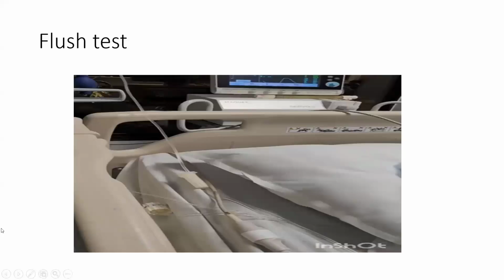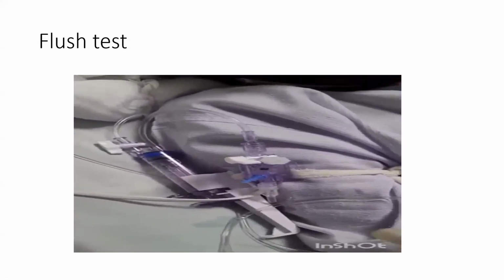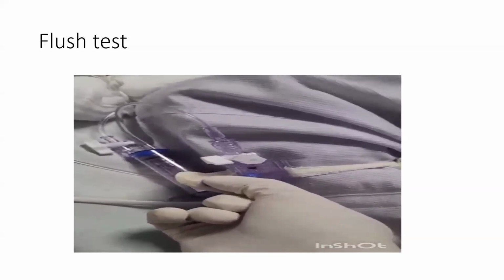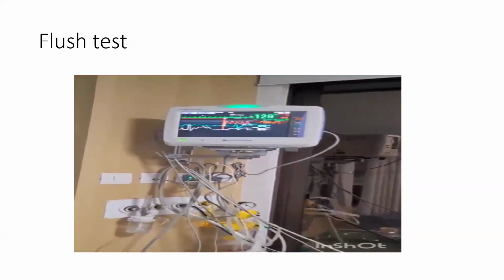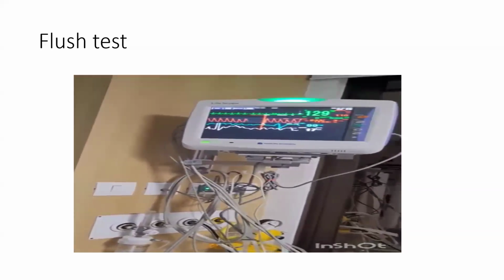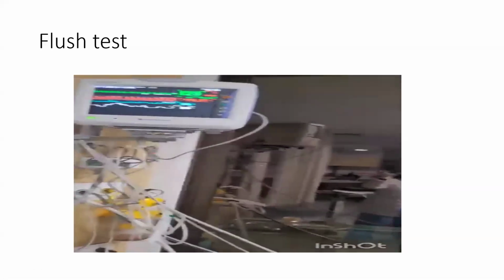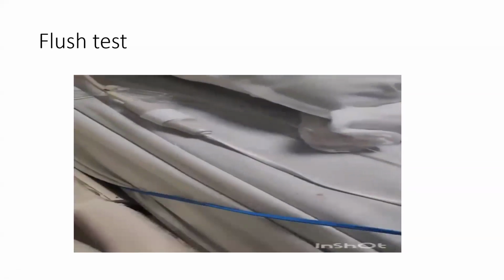Now the next is the flush test. We'll see what the square wave flush test is. After flushing the line, the flat line will come, and after that we can see the oscillations. Now we'll see how we should interpret the underdamped and the overdamped line.